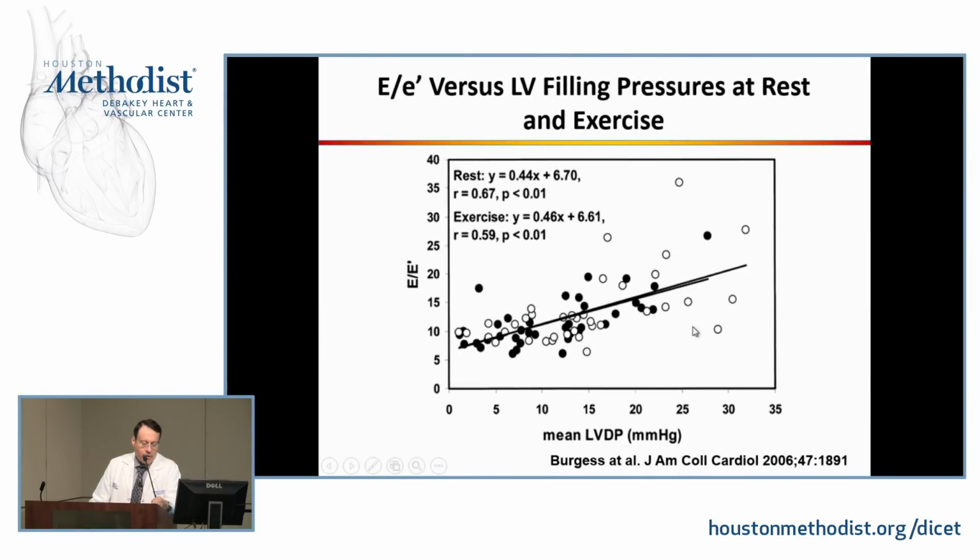This is one of the studies that looked at the correlations. There are very few studies of exercise echo Doppler parameters against exercise cath. There was a decent correlation in these patients, from the investigators who measured mean LV diastolic pressures.